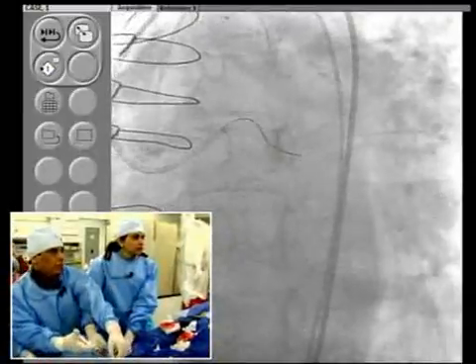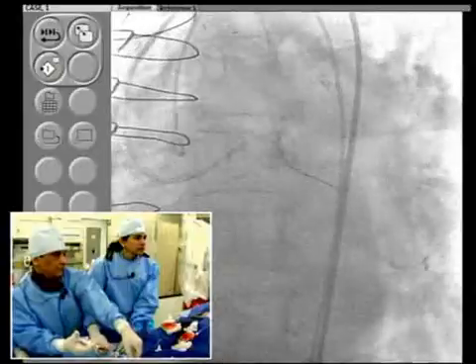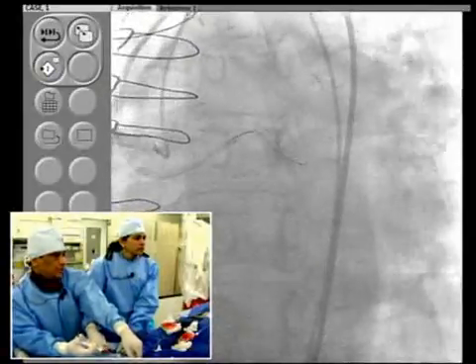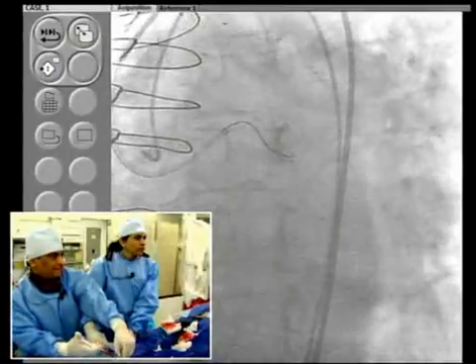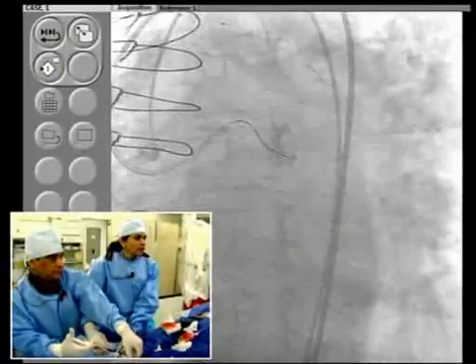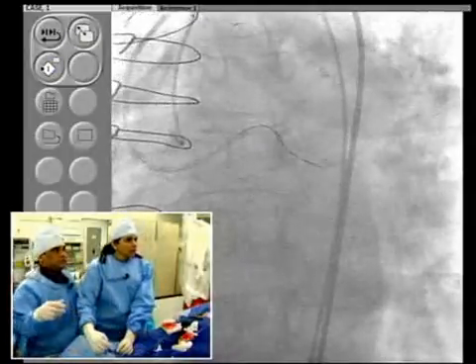And now will be more guided by the contralateral. Another very interesting question has come up, which I think the answer is almost straightforward: what would you have against a strategy of doing just the lesion which makes the most difference, which is the LAD and the left main? And the answer, of course, is the multiple perfusion defects.